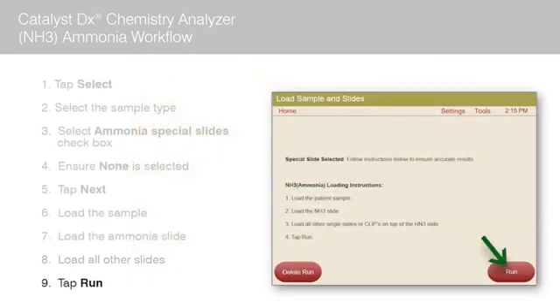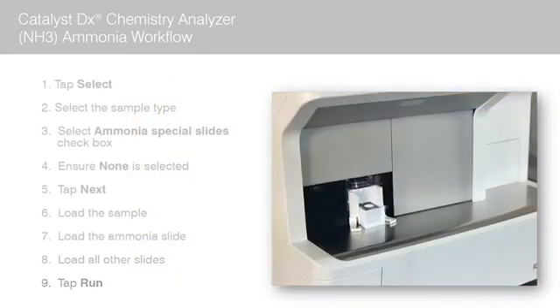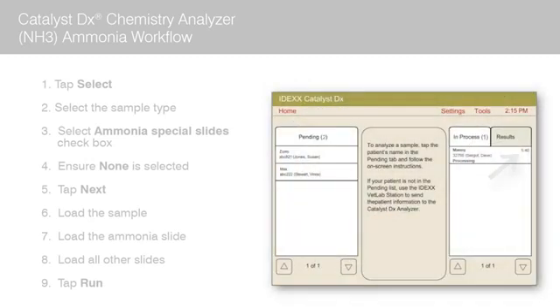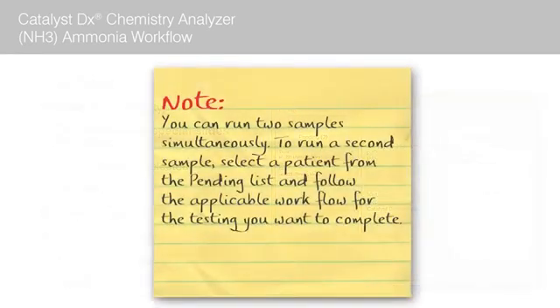Tap Run. The Catalyst DX begins to process the patient sample automatically. A timer displays next to the patient's name in the In Process list, indicating the time remaining until the run is complete. Note: you can run two samples simultaneously. To run a second sample, select a patient from the pending list and follow the applicable workflow for the testing you want to complete.